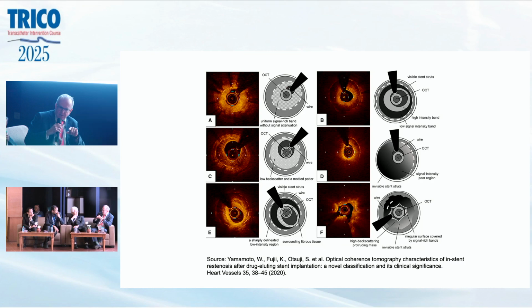And as I look at these, this is not another gold standard in cardiology, because some of these images are not so easy to interpret. And I'm looking forward to even better imaging, with more precision and much easier to interpret. Anyway, that's a sort of long-winded thing. You invited me as the most senior person here, and I'm just confessing my ignorance, but also being open to learn some new approaches.